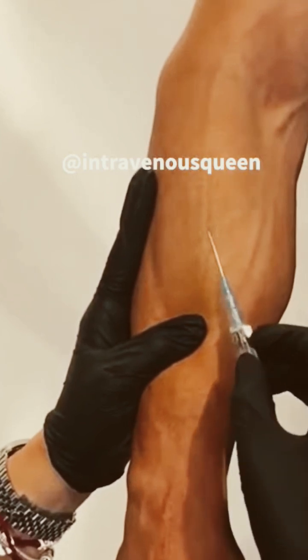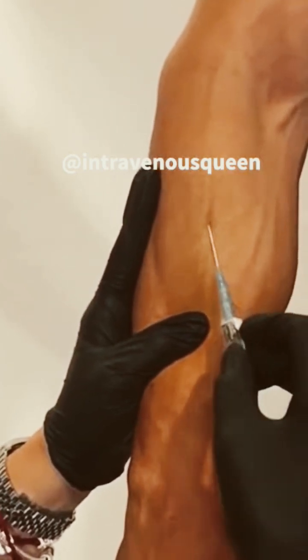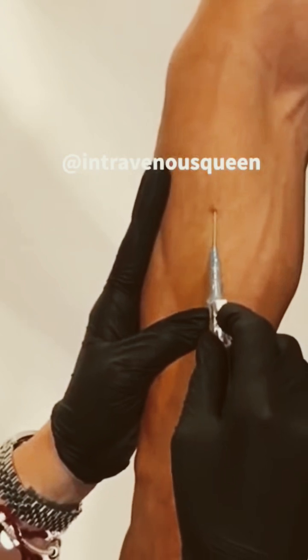Now I'll pierce through the skin initially, and then I'll take the needle and work my way into the vein, as shown.